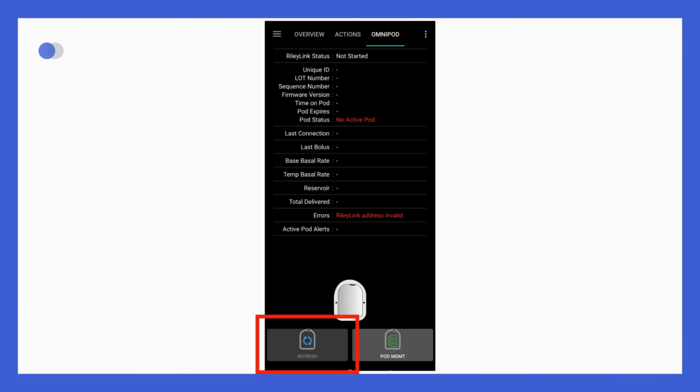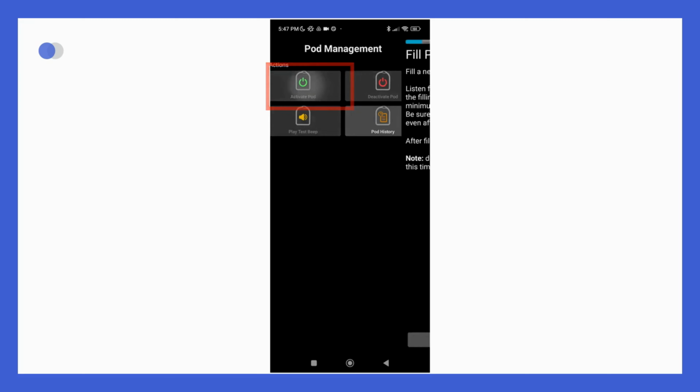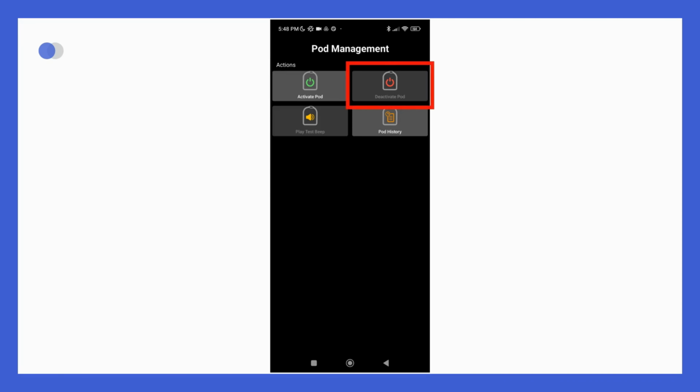Under the pod management section, you will find 4 options specific to the Omnipod Dash. Activate pod. This guides you through the steps of filling a pod with insulin, inserting it, and starting its operation. Deactivate pod. This allows you to deactivate an active pod. Play test beep. This option controls the auditory alerts on the Omnipod Dash. Pod history. Here you can access the history of your Omnipod Dash pods.